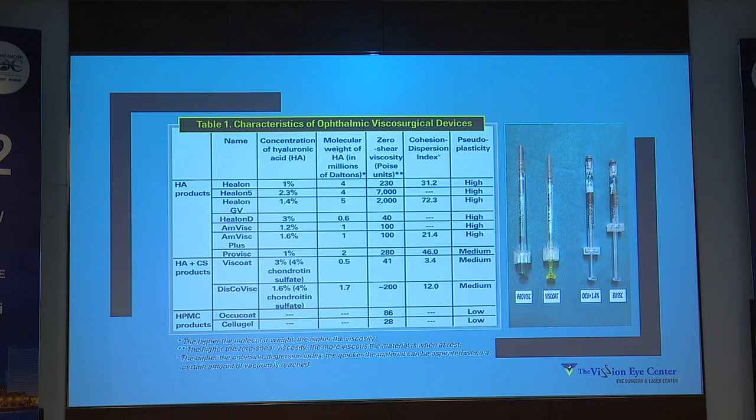If you are doing a rexis in a highly positive pressure, hypermetropic patient with a 20.5 or 21 axial length, extremely shallow AC of 1.8 or something, it always helps that you use a good dispersive. Use your mannitol freely. It shouldn't create a problem for you. In some small eyes of 19, I have also done a small vitrectomy to reduce the pressure.